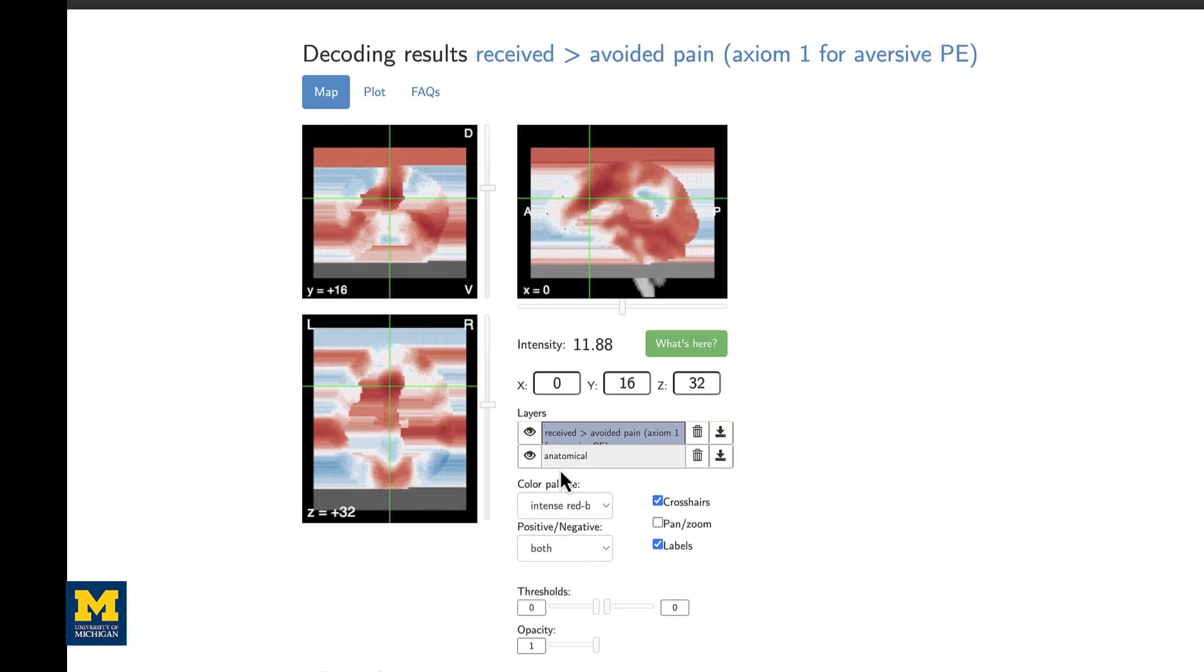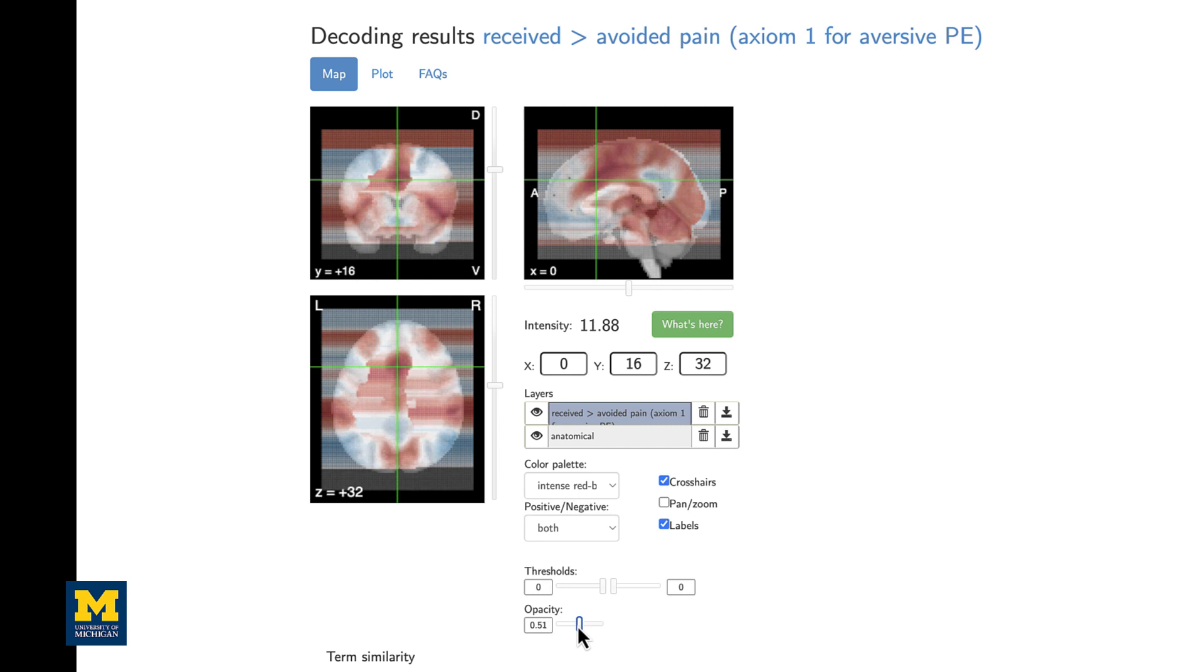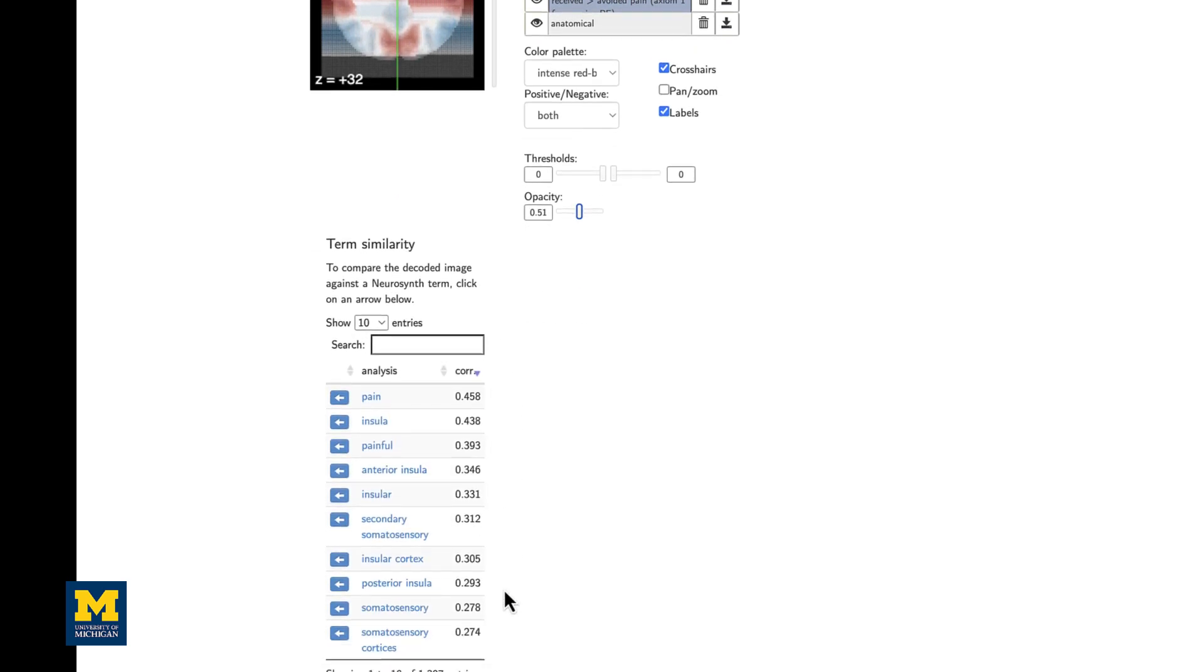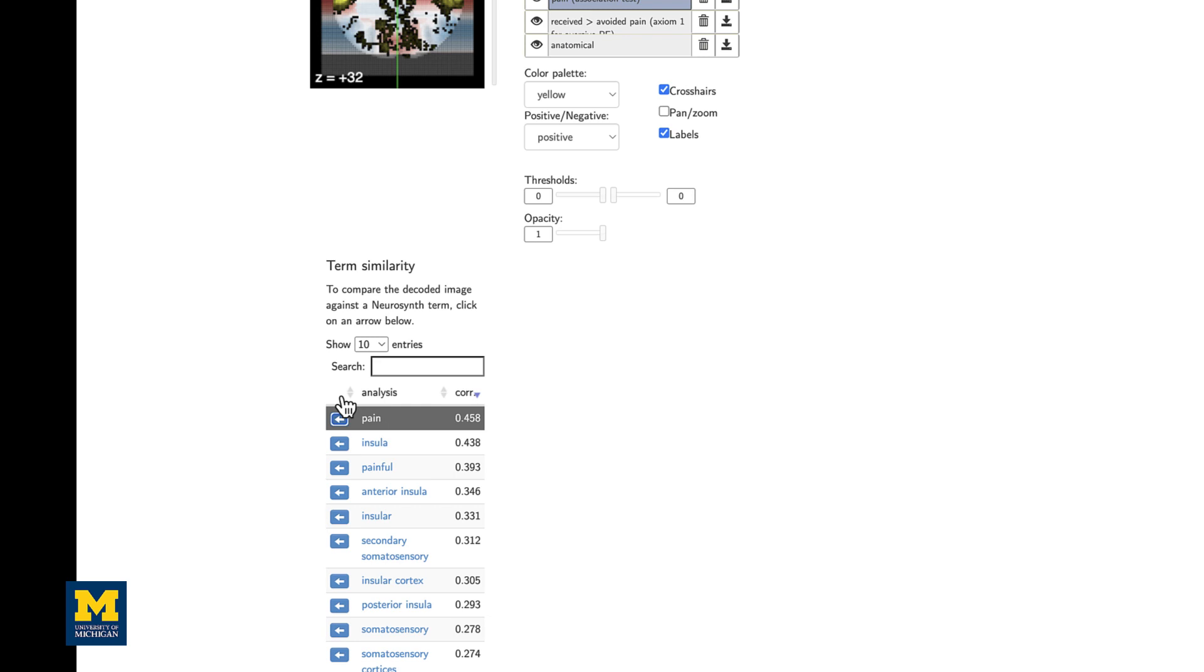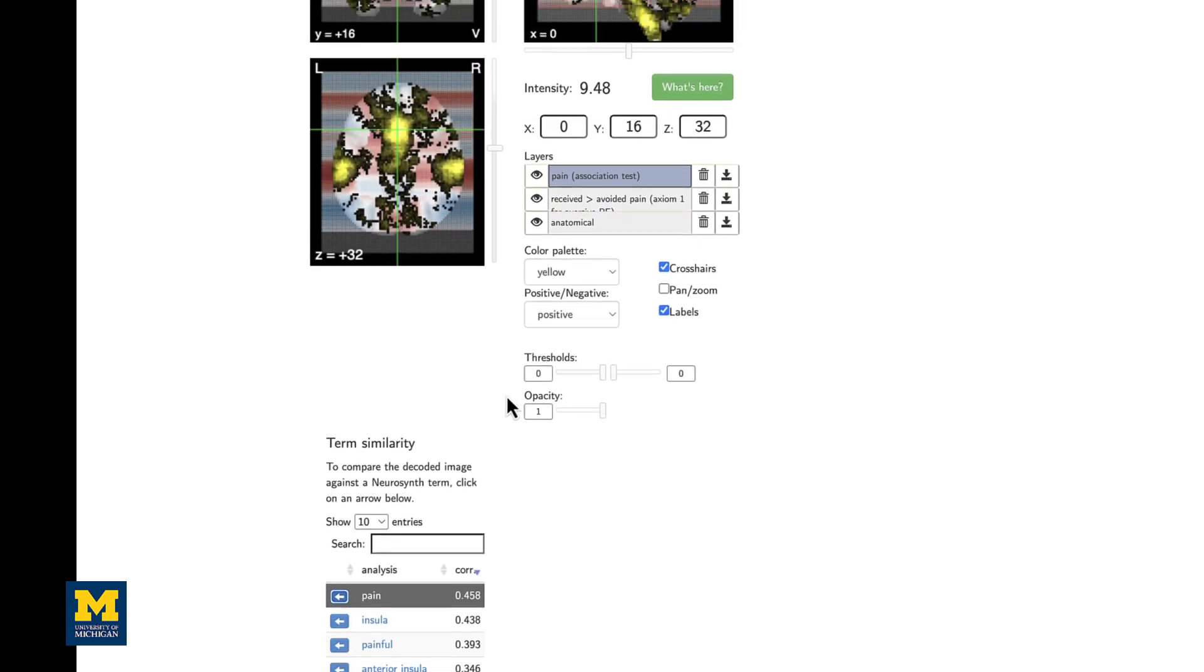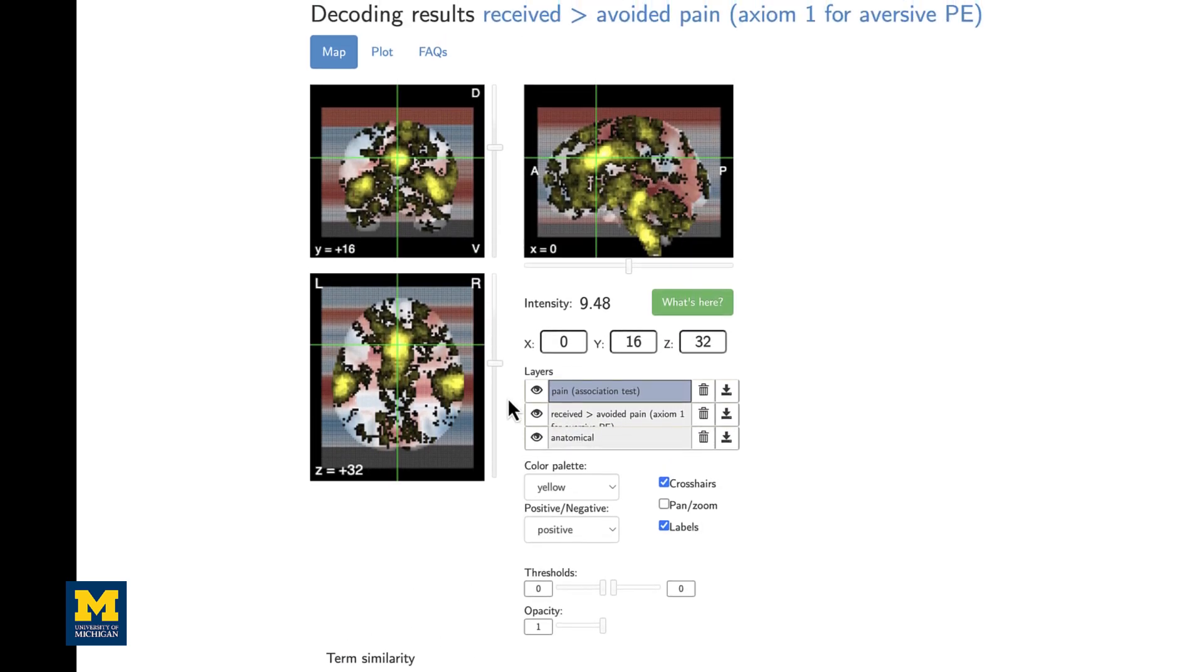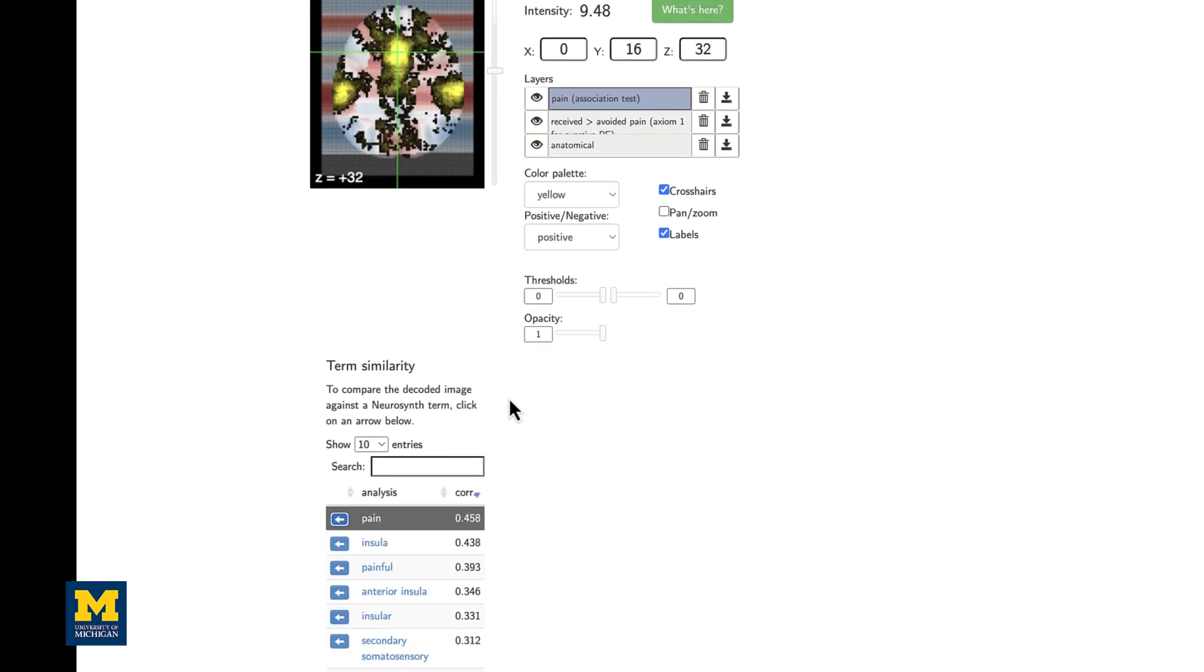You can toggle the opacity to see exactly where the activation lies on this template brain. If we scroll down, as before, you see a list of different meta-analysis terms that have the highest degree of correlation and overlap with that image. Not surprisingly, pain has the highest correlation with that received versus avoided pain contrast.